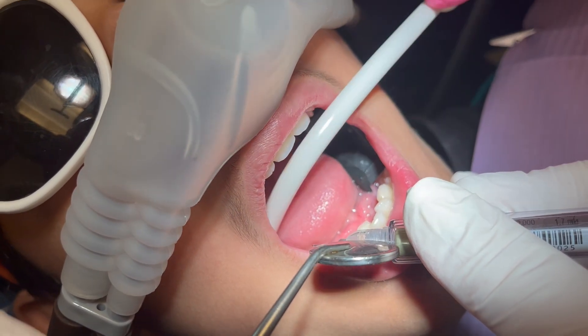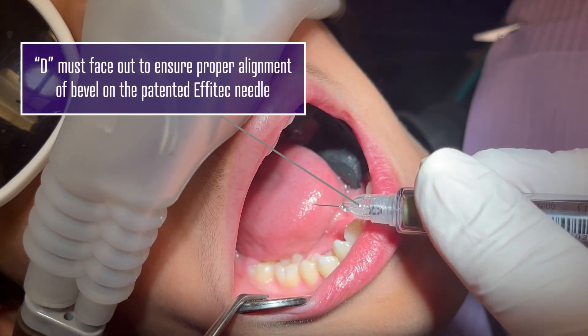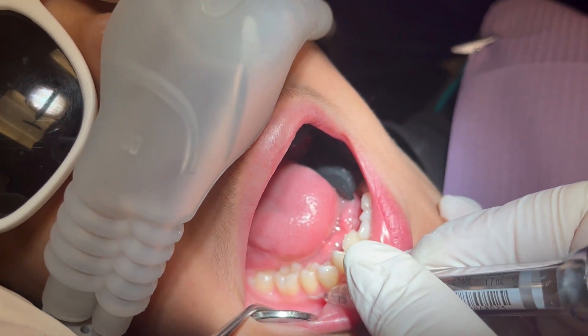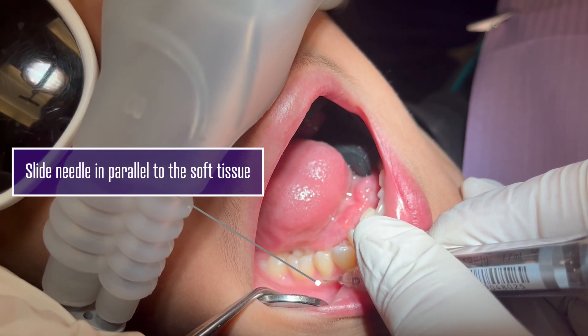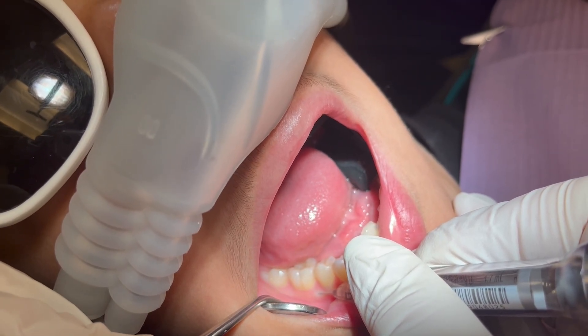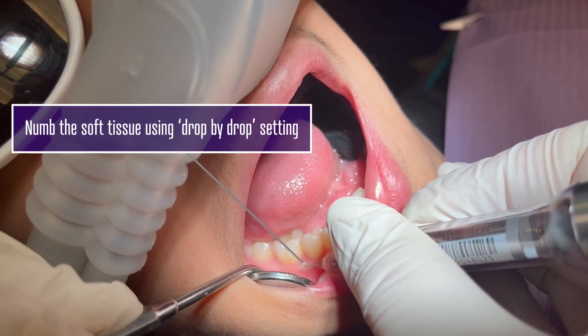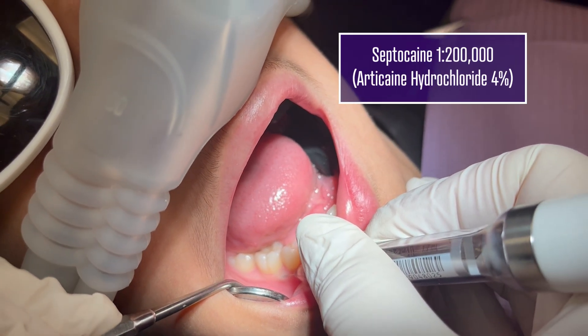Do you see the bevel facing out? I'm going to lay it parallel and just gently glide in there. I'm going to turn on the foot pedal and it should start to beep — the light lit up. Yep, it's going.